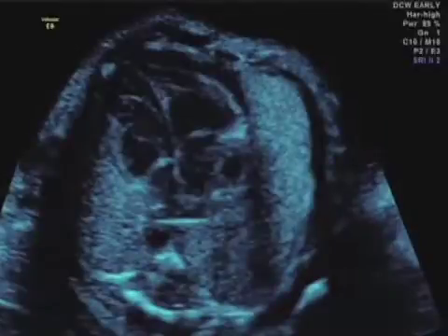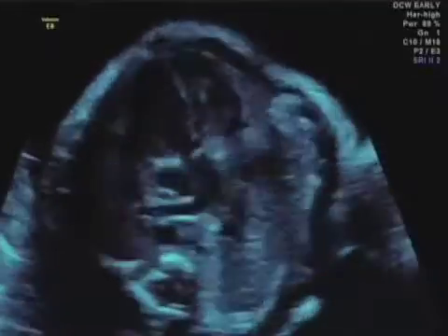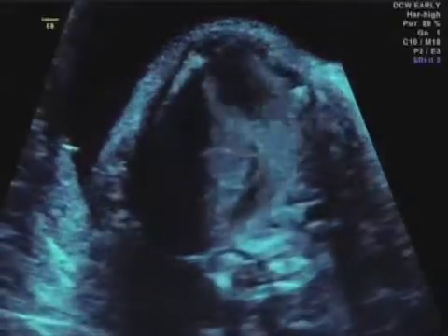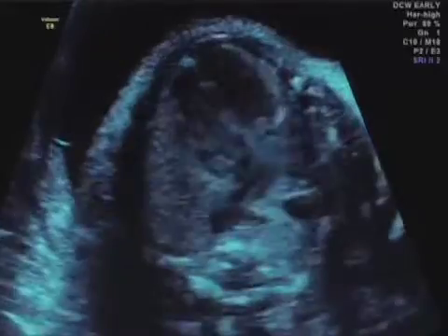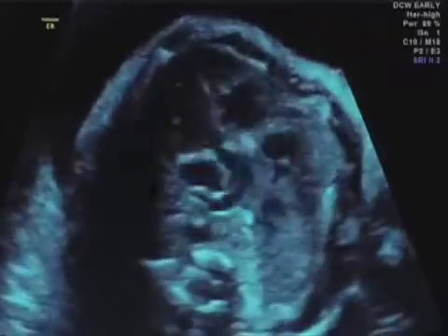The interventricular septum is bowed a little bit much to the left, maybe redundant septum primum. But there we see the aorta coming from the right ventricle, and the left ventricle feeds the pulmonary artery.